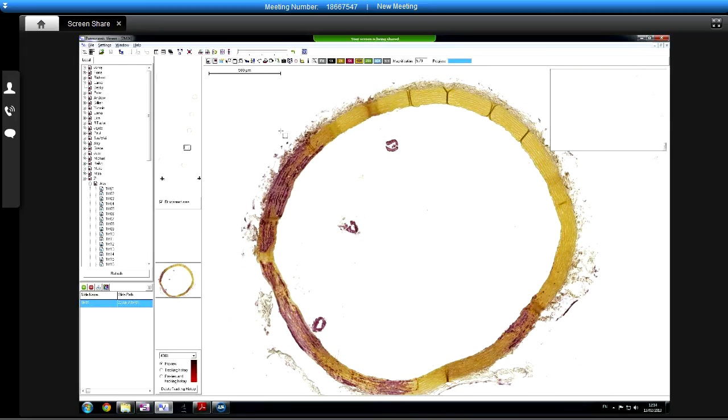It will be different intensity. Oh, I can see that this is lighter, isn't it? I wouldn't want really to count that. You wouldn't want to count these bits in the middle? Basically, I don't know whether it's because this is a ring and I only want to count what's in the ring. This is a lumen. Either I didn't cut these, but it'll be something either on the side.